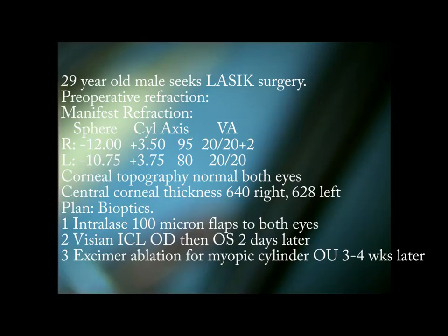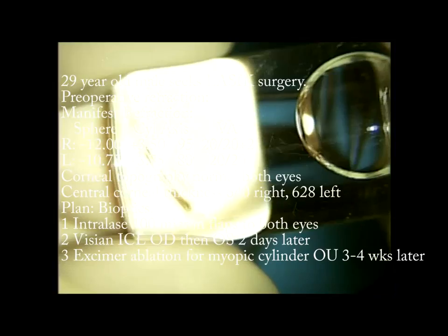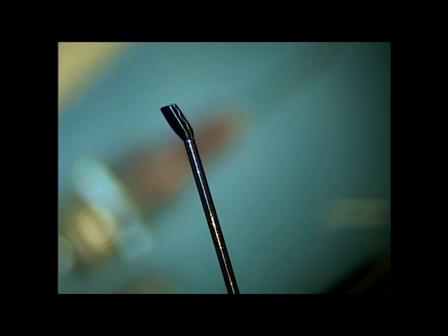This gentleman is a young man who is very nearsighted and wanted LASIK surgery, but due to his preoperative flat cornea, we decided to do a bioptics approach. So this is how we use the ICL, and we've actually created flaps on this gentleman to start. I'll just show you the ICL part.